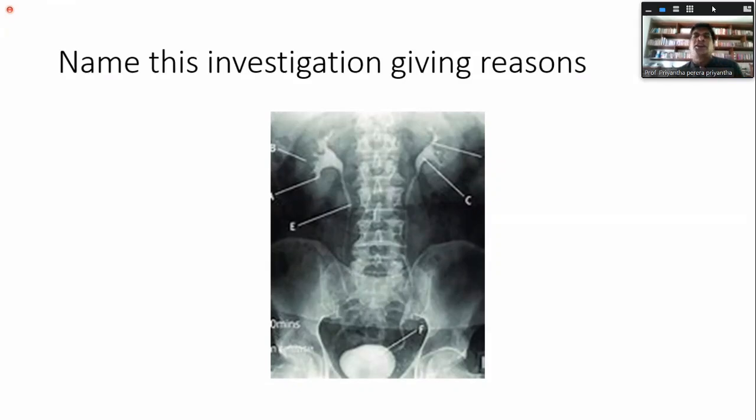When you take a chest X-ray or X-ray of the skull or any other place, we tend to cover the genitalia with lead plates. Lead plates are placed over the ovaries and the testicle area, so that radiation won't reach the gonads. But you can't do this in an MCUG, because you would be obstructing the view of the area you want to look at. So the gonads will be directly exposed in an MCUG. So the risk of mutations, radiation damage, is high with the MCUG, right? Those are the two things we mainly worry about when doing MCUGs.